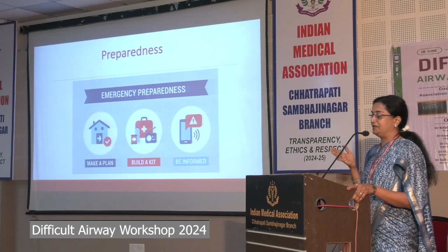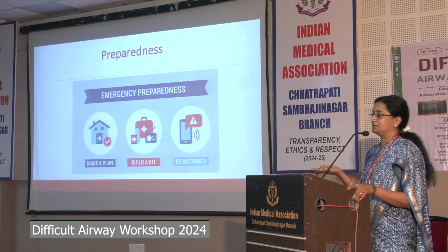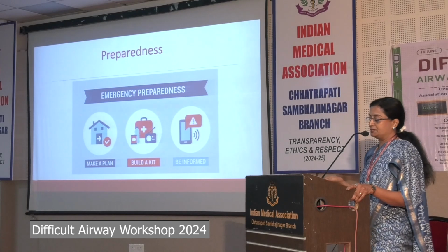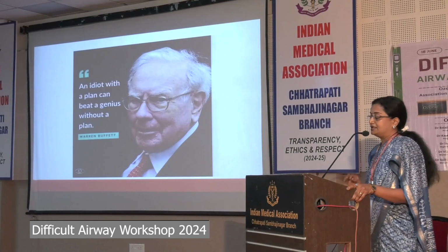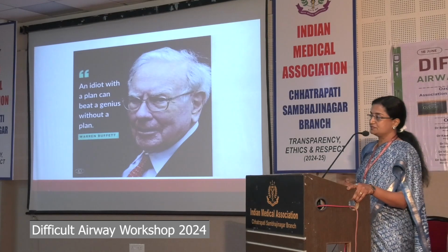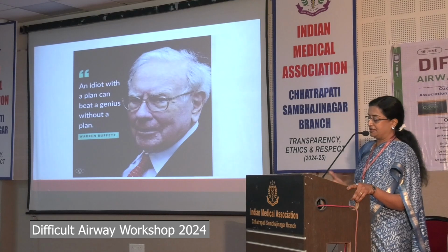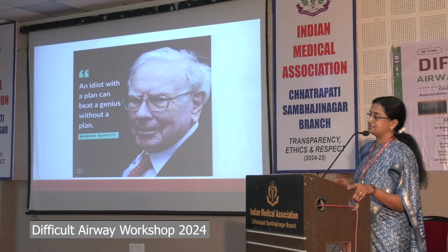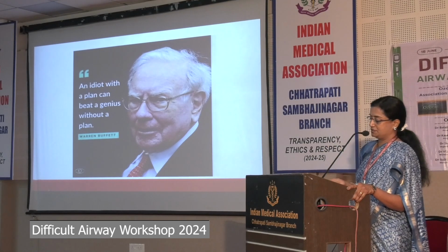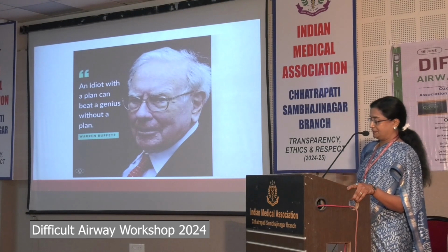So first of all, make a plan, build a kit with the equipment which you are comfortable with and know well. Be informed of its advantages and disadvantages. An idiot with a plan. Since morning, in all the lectures we are giving you this key: a plan, and plan, and plan first. You have your plan A, B, C and D in place before you begin the case, in the PAC itself, right up to the extubation. So an idiot with a plan can beat a genius without a plan.